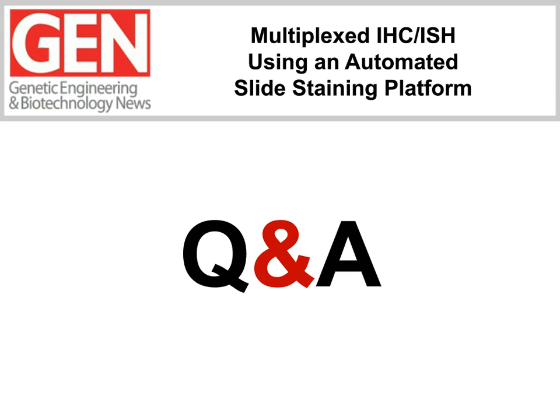Well, multiplexing is important from the standpoint that in tissue, if you look at just a regular DAB stain or a single stain, it only gives you a limited amount of information. If you're interested in looking at two antibodies that are in the same pathway, for example, and they work in connection with each other, it is good to look at the tissue and actually see that those two proteins are being expressed in the tissue.